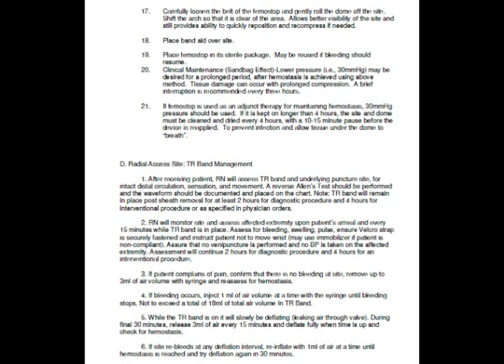While the TR band is on, it will slowly be deflating, like I said, passively deflating. And during the final 30 minutes, you're going to release 3 milliliters of air every 15 minutes. If it starts to rebleed, then you will put 1 milliliter of air in it till it quits bleeding, and then you will try deflation again in 30 minutes.